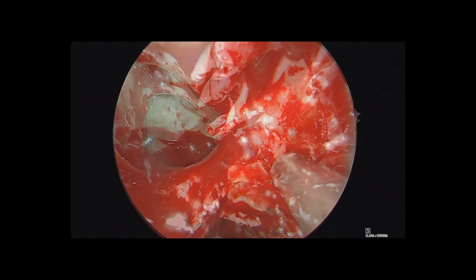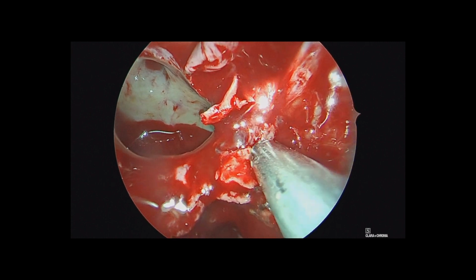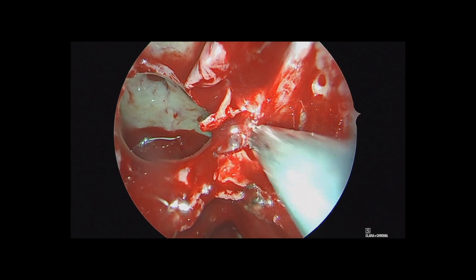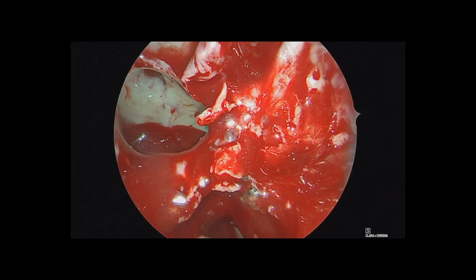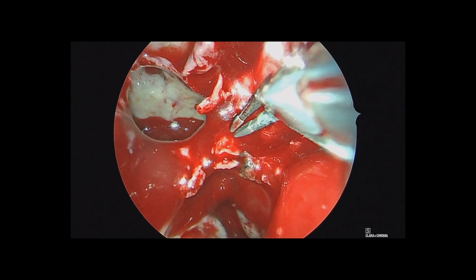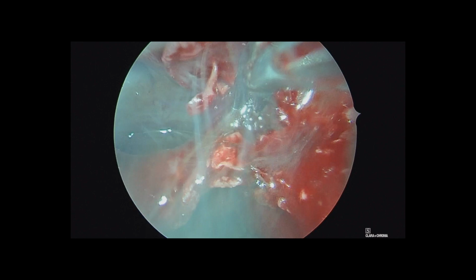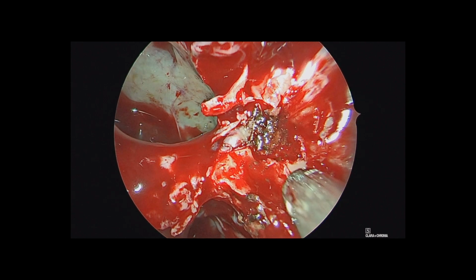We'll continue to open this area up more laterally, as you can see here, exposing the soft tissue of the pterygopalatine fossa, as it contains things like V2, the sphenopalatine artery, as well as the pterygopalatine ganglion. Here we are using a bipolar just to take care of a small branch of the artery as we dissect that area to visualize it a bit better.